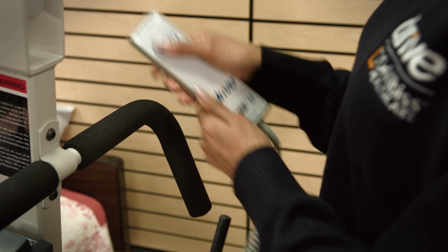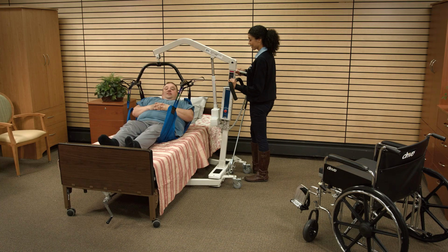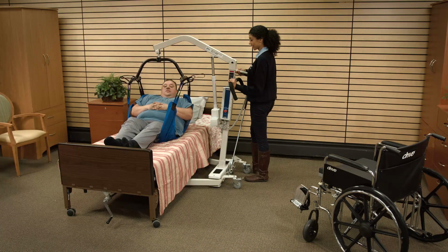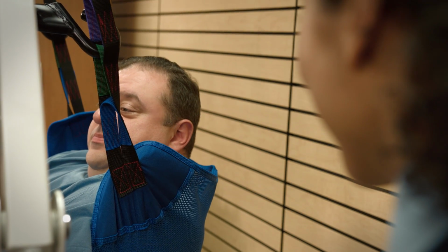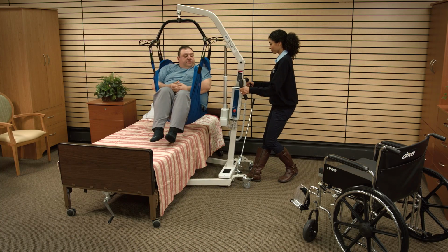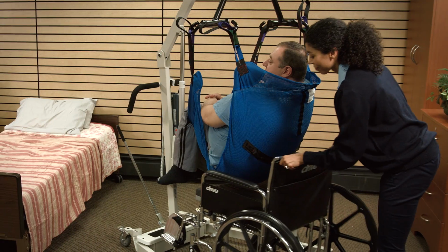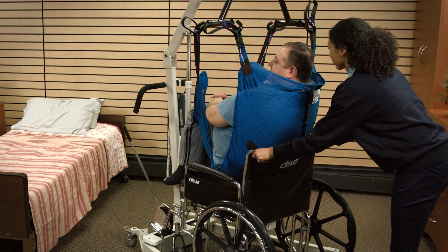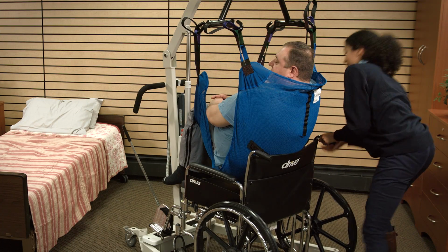To lift the patient, press the up button on the control handset. Lift the patient until his or her feet will swing easily off the bed, ensuring that the patient is at all times facing the attendant. Next, transfer the patient to the commode or wheelchair and position above the seat surface. Then, lock the brakes of both the lifter and the commode or wheelchair.